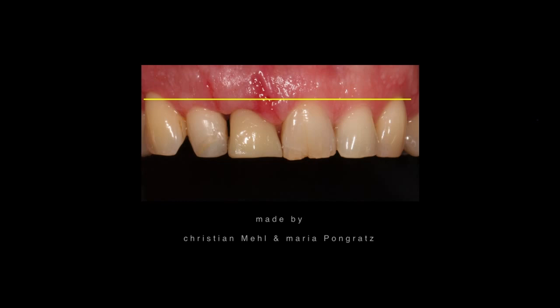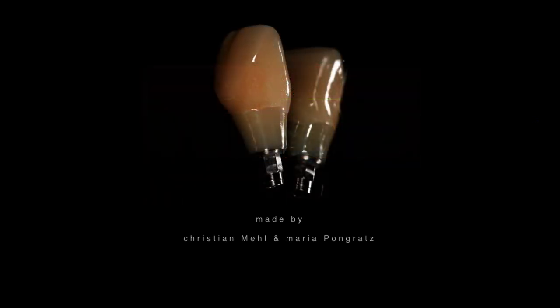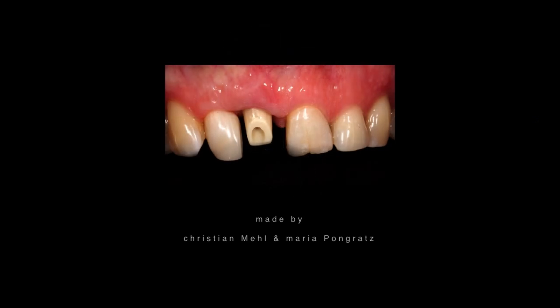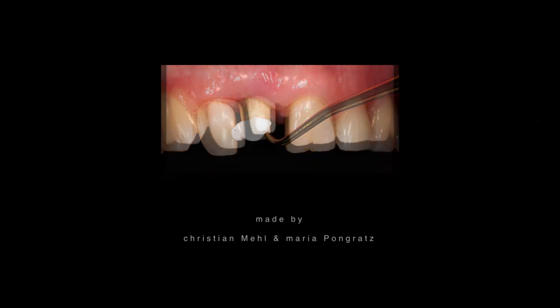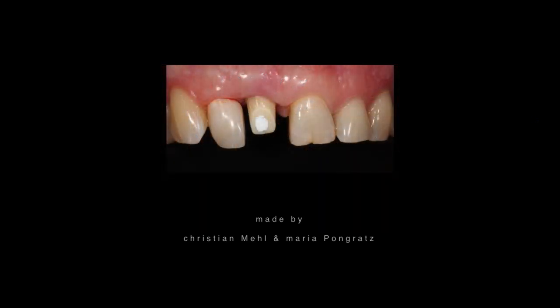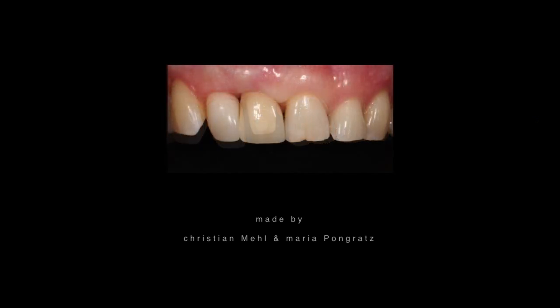This is the X-ray directly after the implantation. You can see we're safe when it comes to the vertical tissue situation, but distal the papilla is gone because of inflammation. And here we can see then 3 months later the final restoration, and the abutment is placed in position. In this case we will cement the crown, as otherwise the exit of the crown, the screw channel, would have maybe impeded nice aesthetics because it would break through the incisal edge.